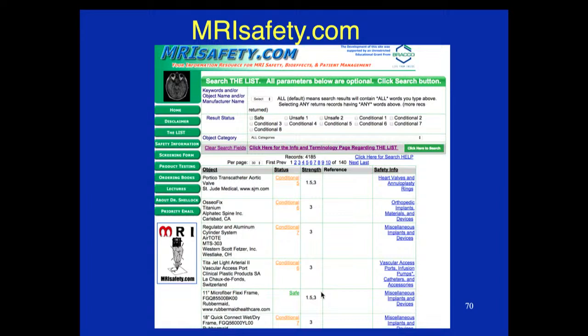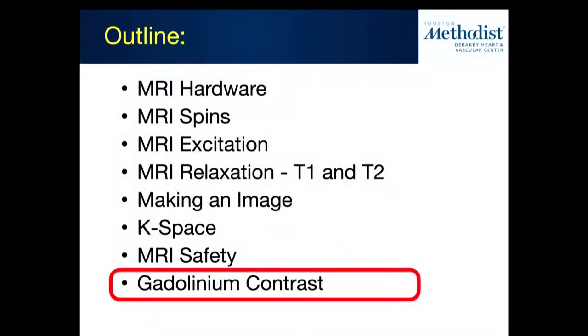There's a screening that happens at the MRI lab itself. So the staff will try to make sure we don't miss any of these cases. But you don't want to have your patient go down for no reason. As a fellow, you can also try to do a screening as well. And if it's labeled as MRI unsafe, you can probably say this person can't be done. Okay. So the other thing to think about is gadolinium contrast.